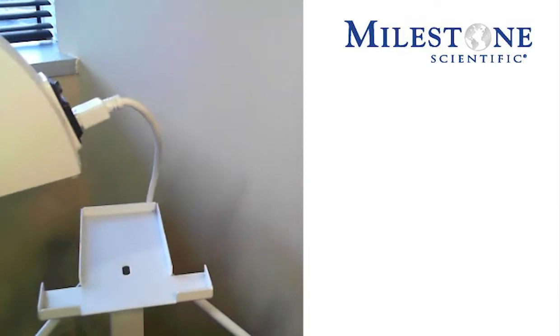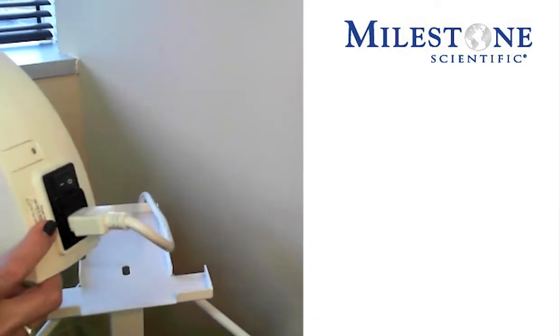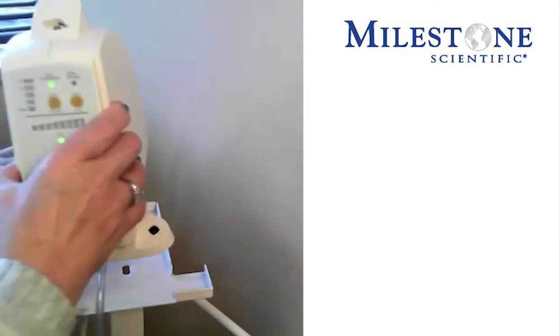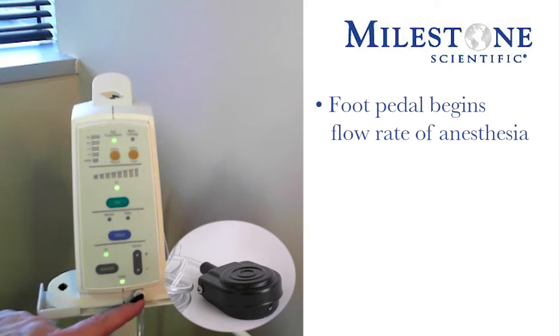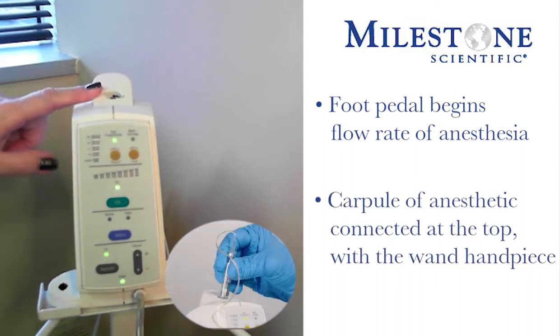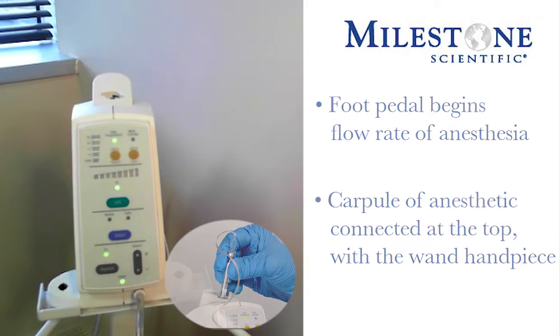The STA Single Tooth Anesthesia System: the plug gets attached to the back of the instrument, and there is a power switch in the back. The foot pedal will get attached just below the volume indicator, and that foot pedal is going to be the way that you will begin your flow rates of anesthesia. The carpule of anesthetic will be engaged into the top part of the instrument itself with the wand handpiece.